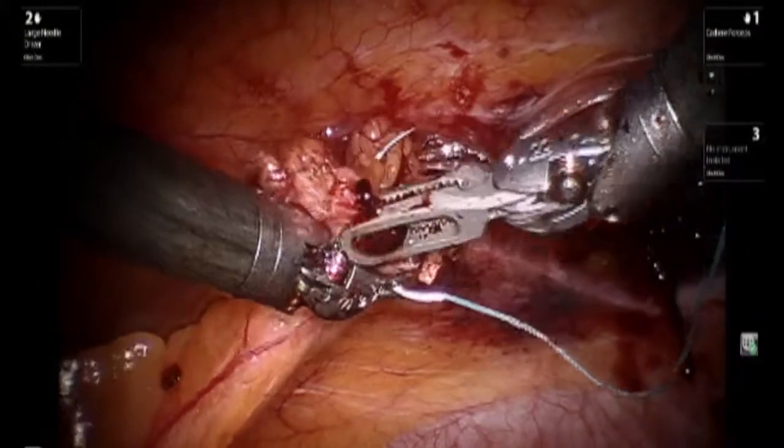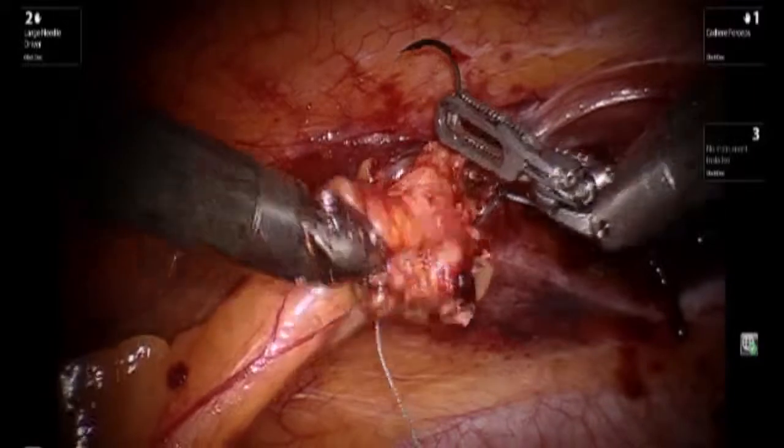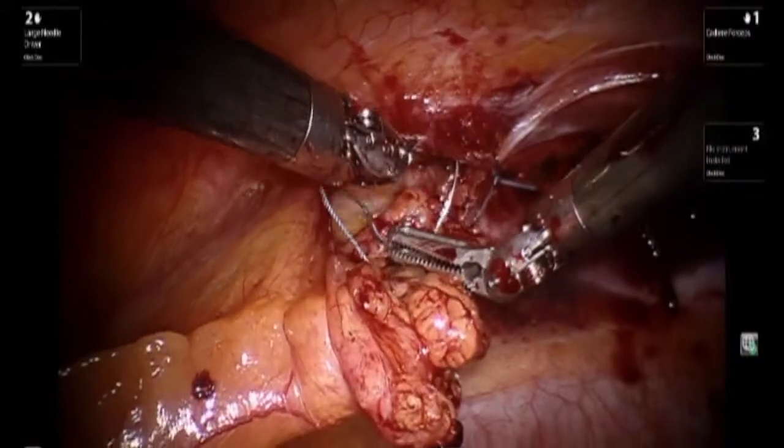A decision was made to approximate the portion of fat that was taken off the abdominal wall when visualizing the edges of the ventral hernia, and at this point it is being placed back into an anatomical position.